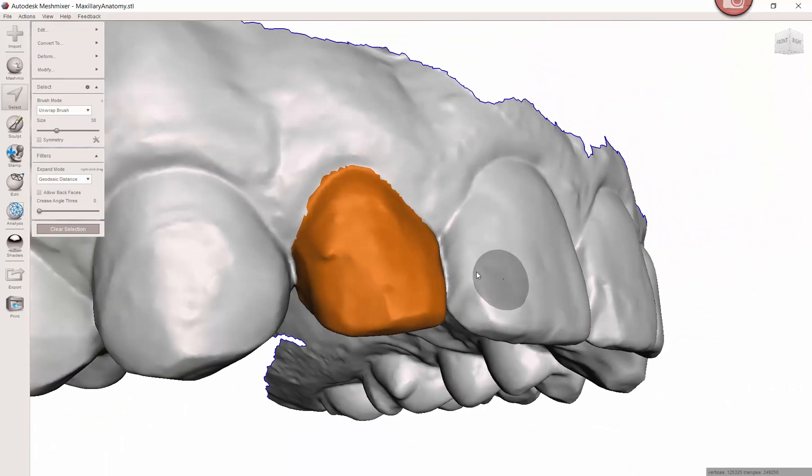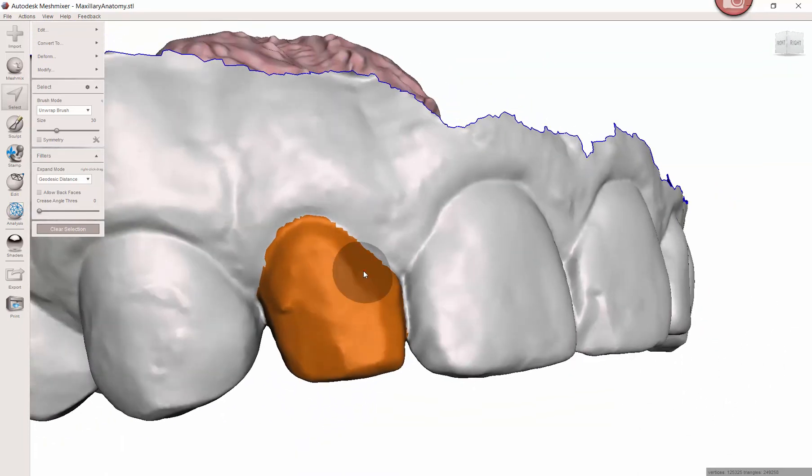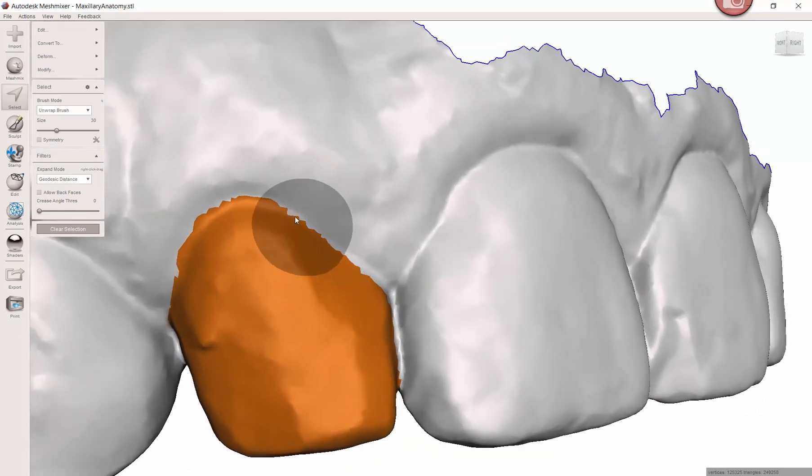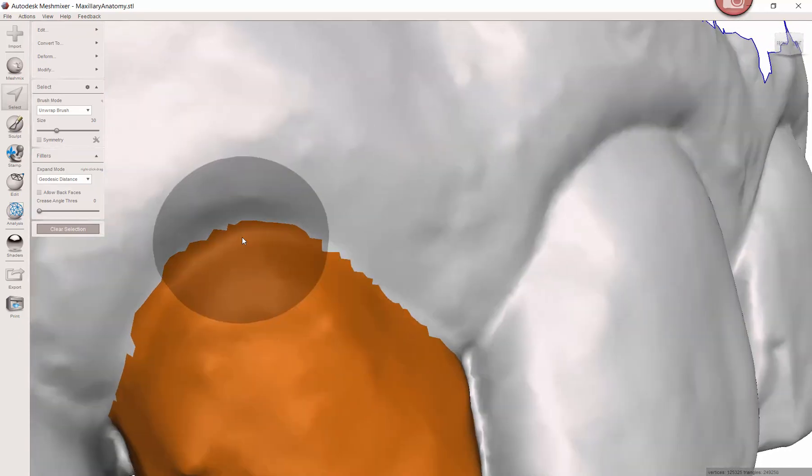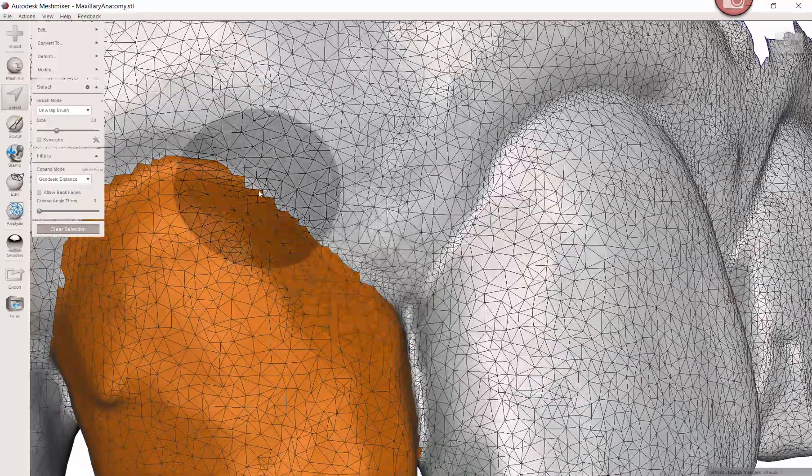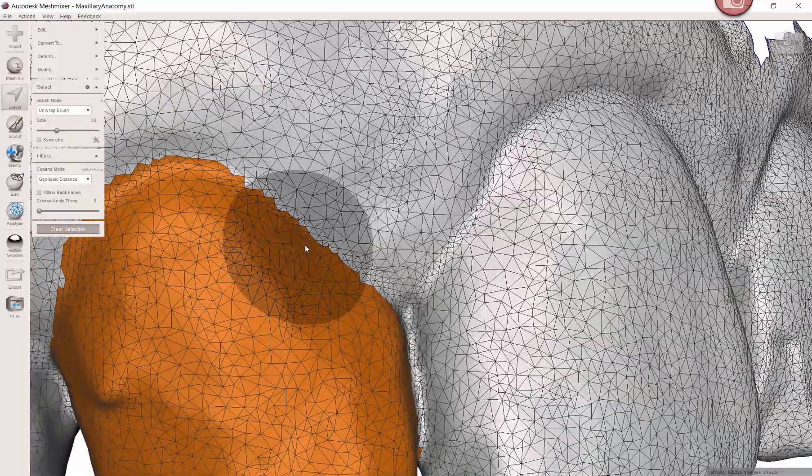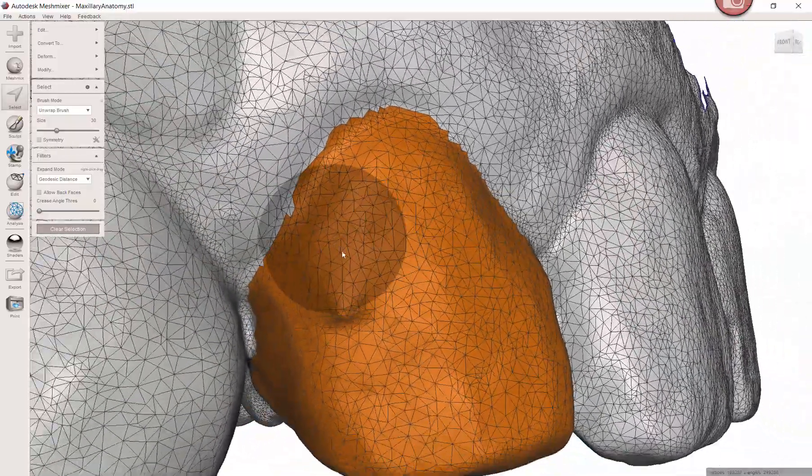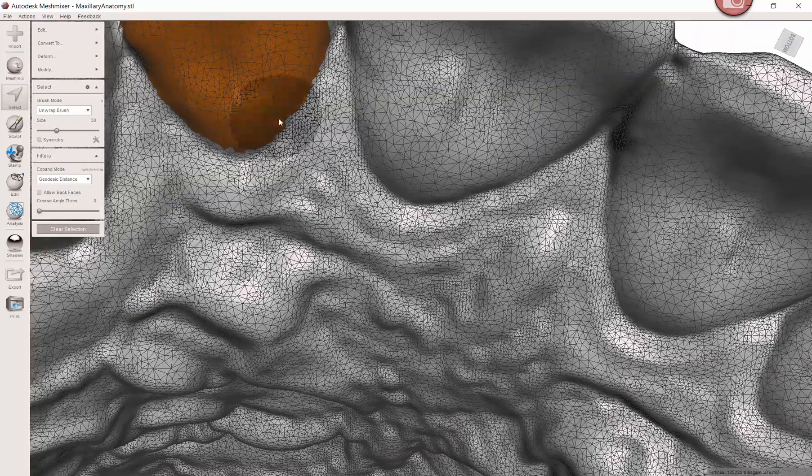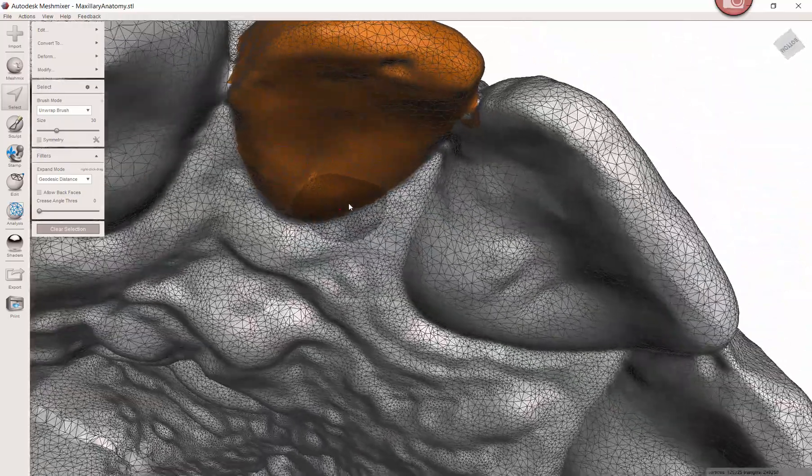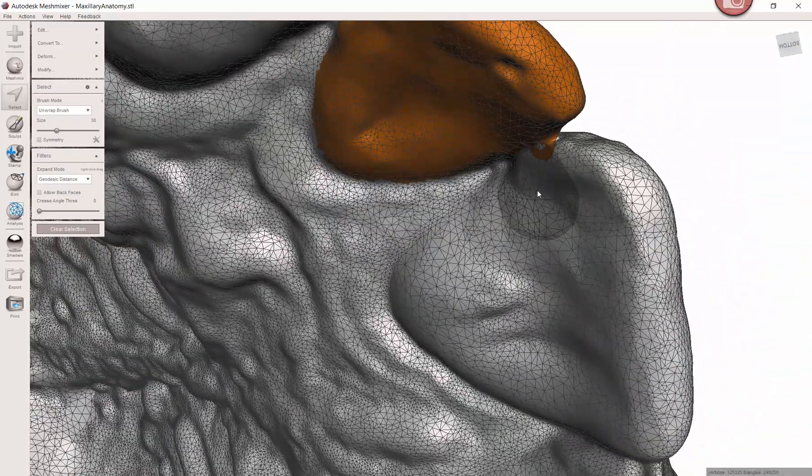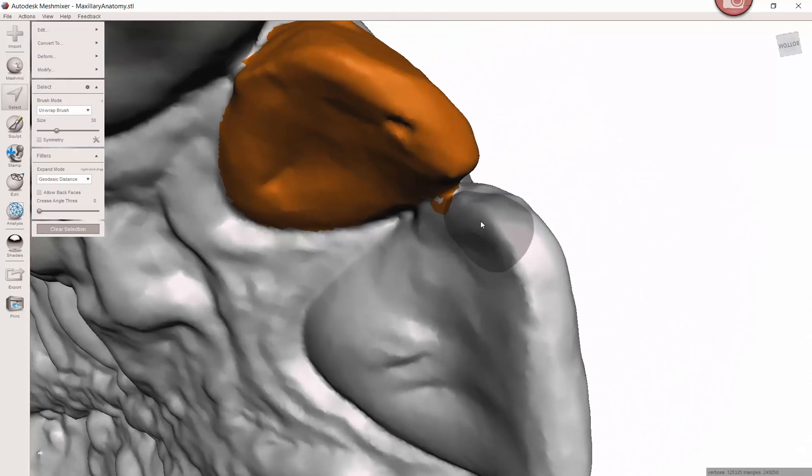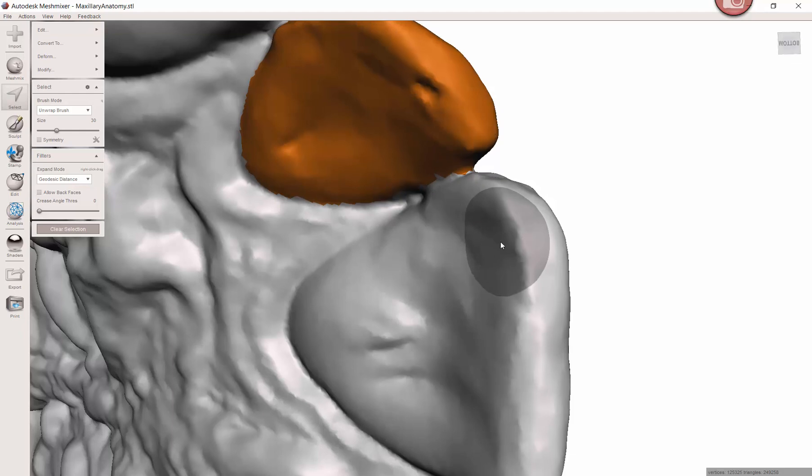I like to try and smooth this edge. You can see that it's jagged because every surface is made of triangles. If I press the W button, I can actually see the triangles, the mesh that creates the surface, and that's why you always end up with this sort of jagged area. I'm going to deselect this area, didn't mean to get the adjacent tooth here.